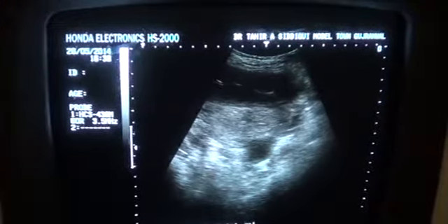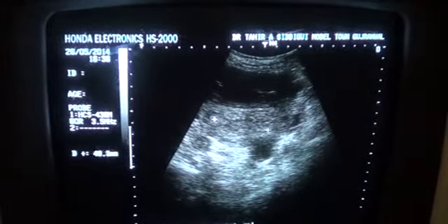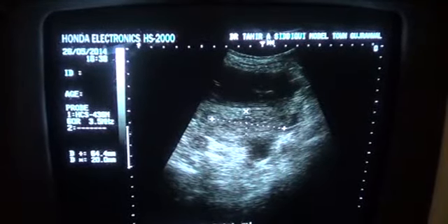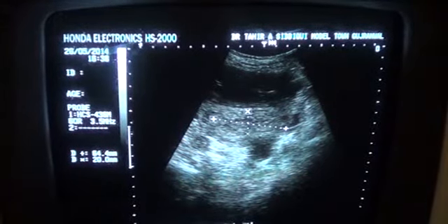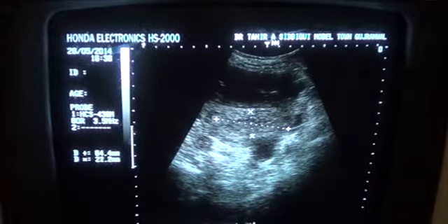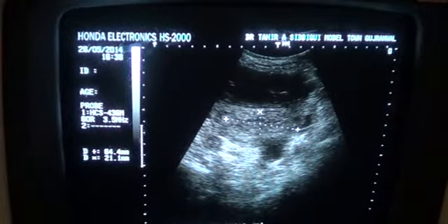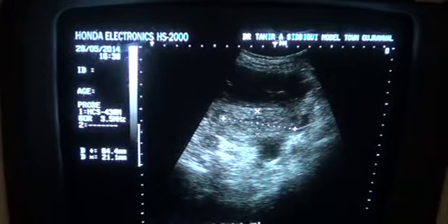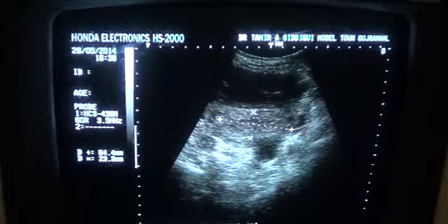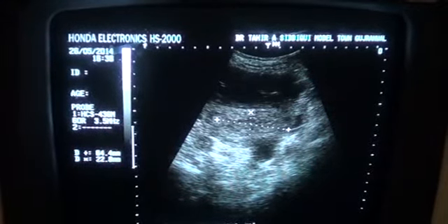What I see is that this is the uterus. Here we see this is the uterus, and it measured 6.4 by 2.0 centimeters. Now I think it is measuring a bit less because of a lot of fluid with septas within the abdomen. The pressure is reducing the anterior-posterior diameter of this uterus. Otherwise, this will be taken as a small size uterus in anterior-posterior diameter.